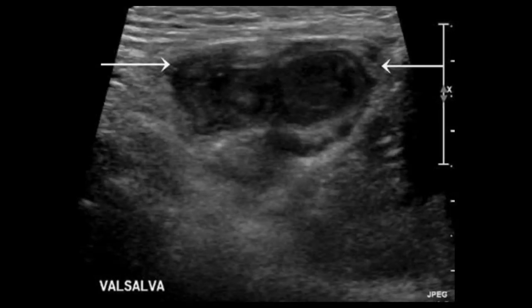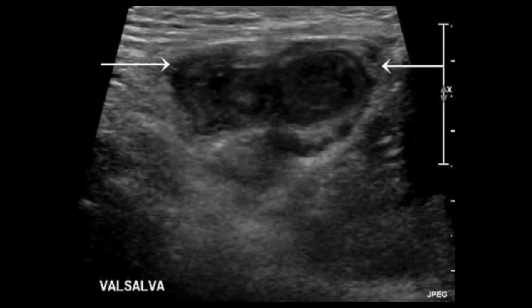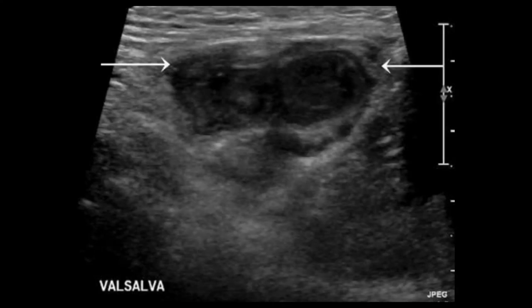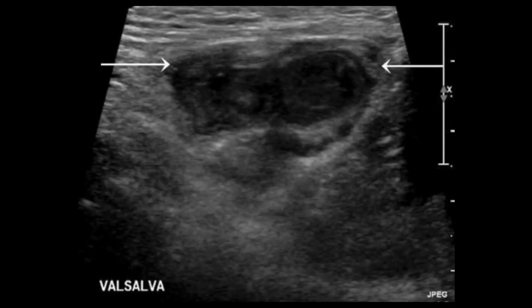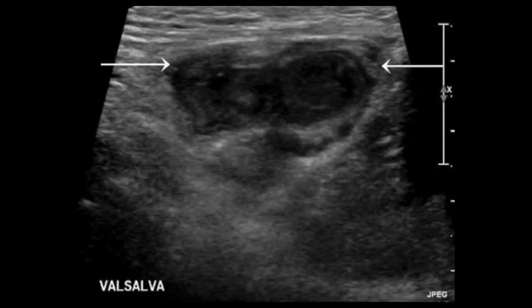Apply the Valsalva maneuver if important. Ask the patient to stand up and in upright position look again for herniated contents, reducibility, and irreducibility. Also comment on whether it is tender or not. This is a classical example of indirect inguinal hernia.